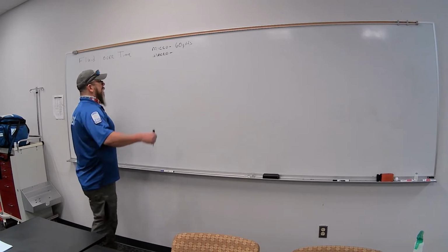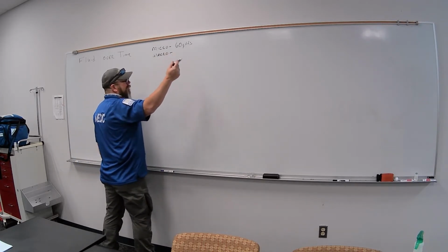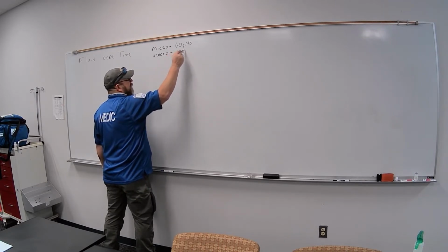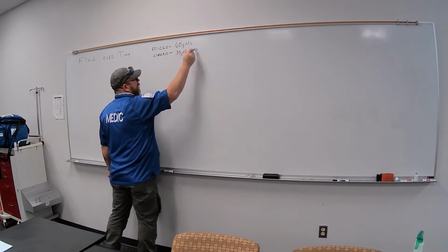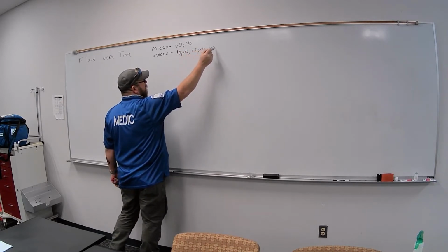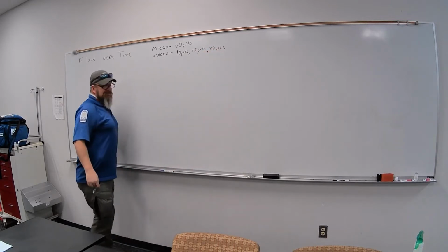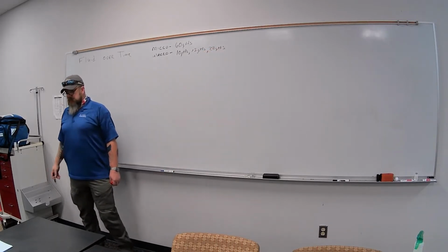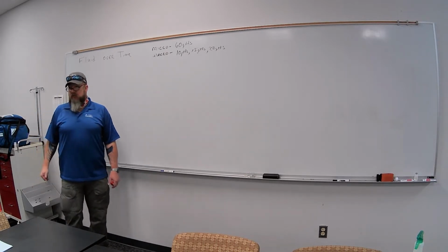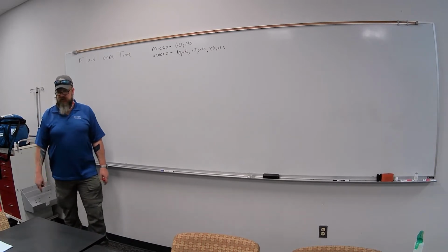So what would a macro drop set be then? For trauma, 20. You think more of trauma. You've got 10 drop set, 15 drop set, 20 drop set. I've never seen a 15 or 20. Well, they have them individually, and remind me, I'll show you all later.